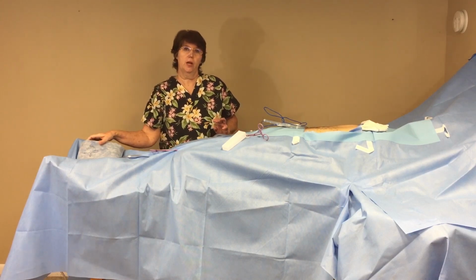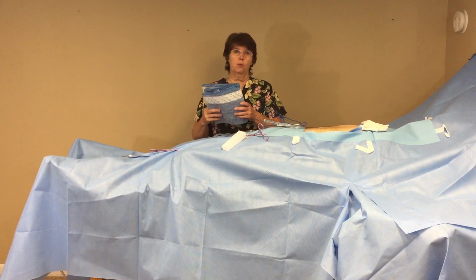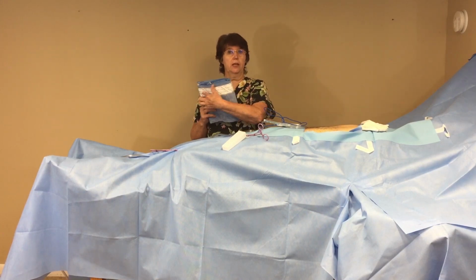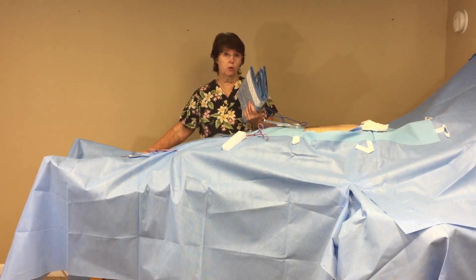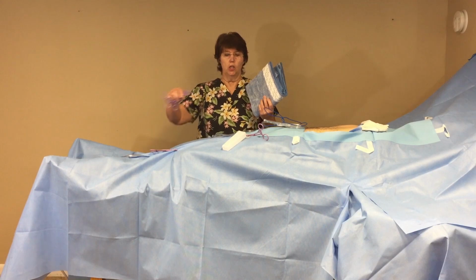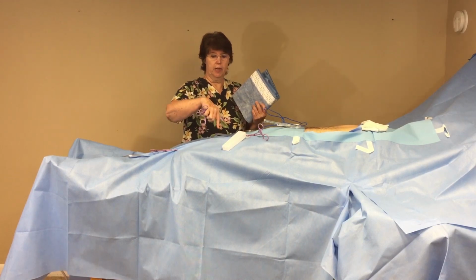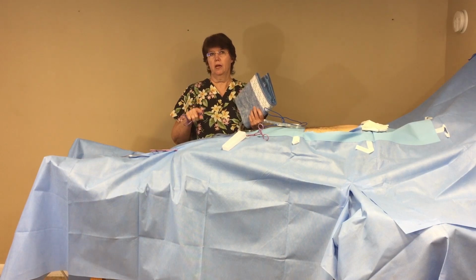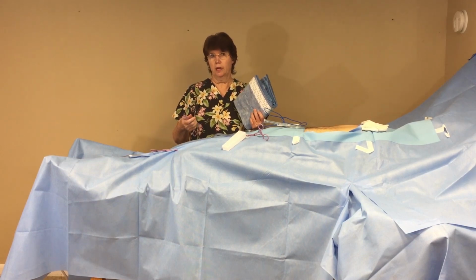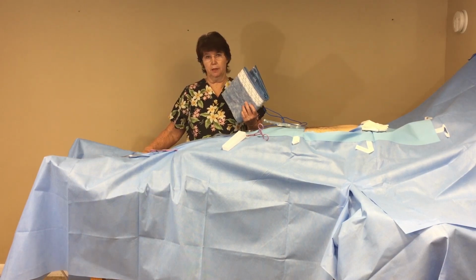Then you want to get a drape. This particular one is ideal because it has a sticky on it. If you don't have one that has sticky, you would have to use a 3/4 or a half drape, 3/4 is better than a half drape, you would be able to clip it here, here, and here and get the same effect, because I think you'll see that I'm preserving the sterility pretty well by doing this.